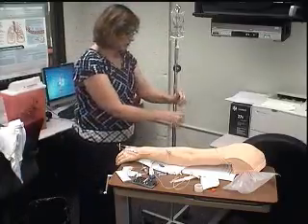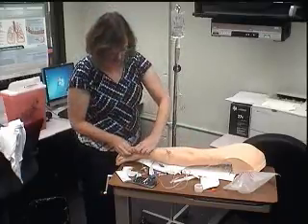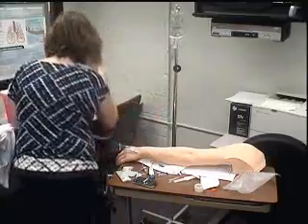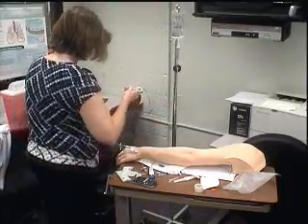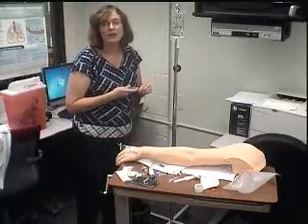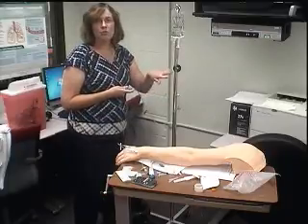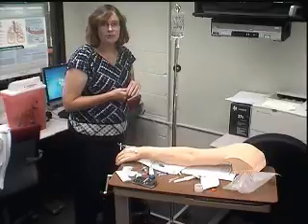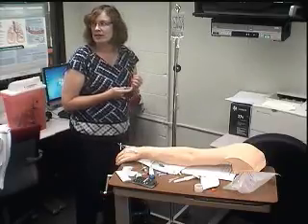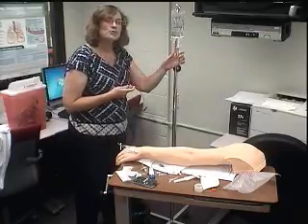Now I come over here. This is how you adjust up and down, makes it flow. And I don't want to have it flow to my arm, so I'm just going to show you what happens. I need to have 12.5, which is kind of hard to do, so about 12 drops per minute, right? I could put it on a pump and do that accurately, or I can count it. Now, it's hard for me to sit and count something over a whole minute, but it's pretty easy for me to count something over 15 seconds. So 60 seconds divided by 4 is 15 seconds. So 12 divided by 4 is 3. So I need 3 drops for every 15 seconds.